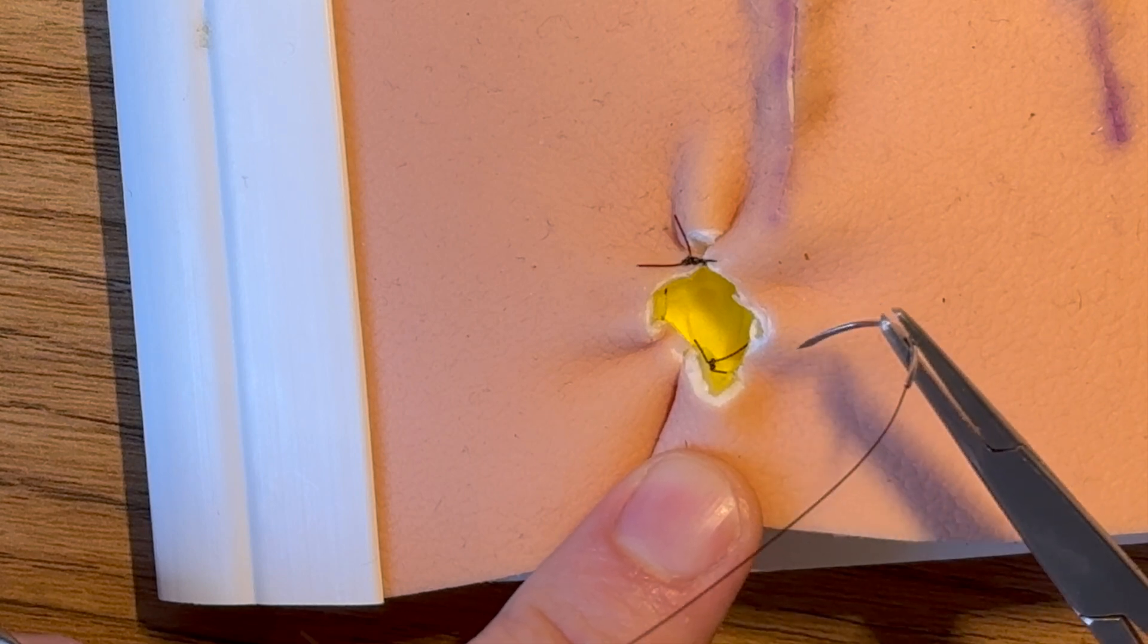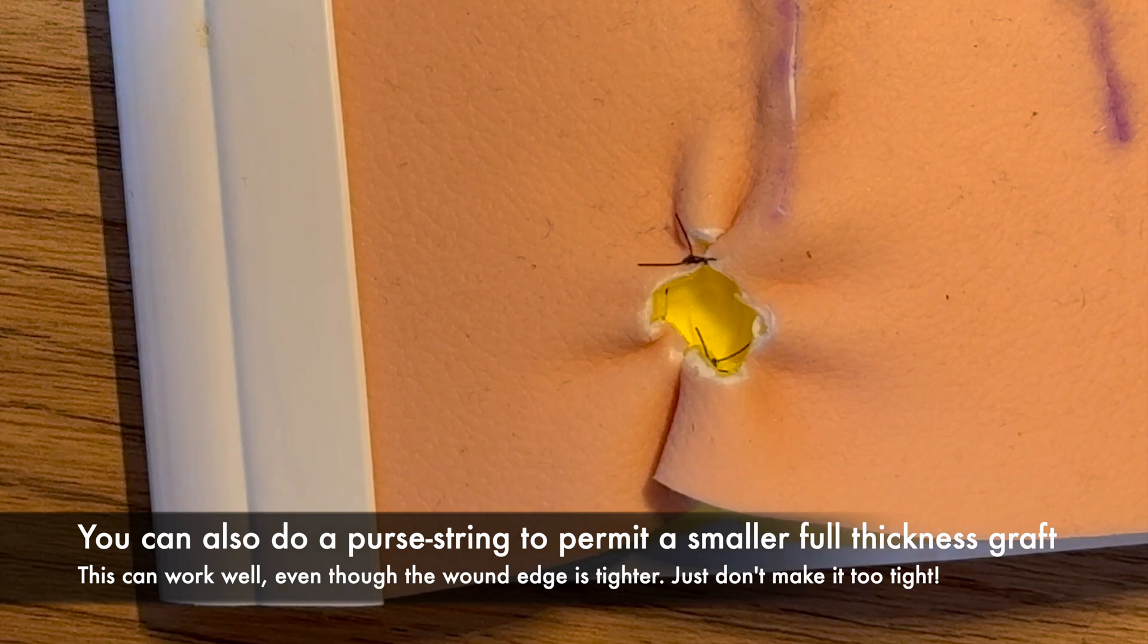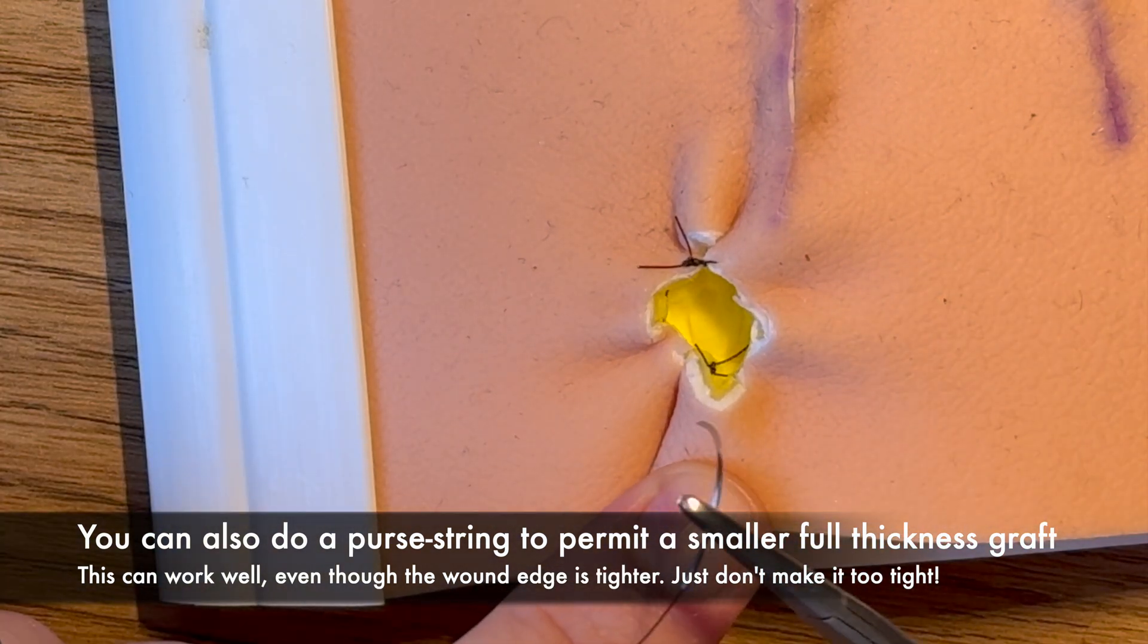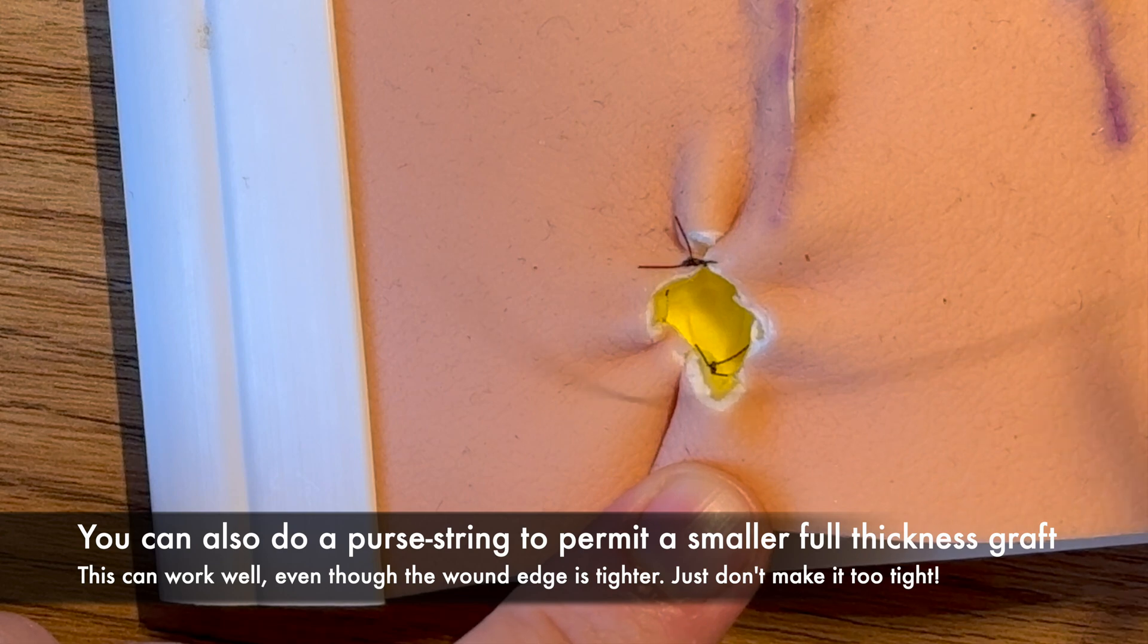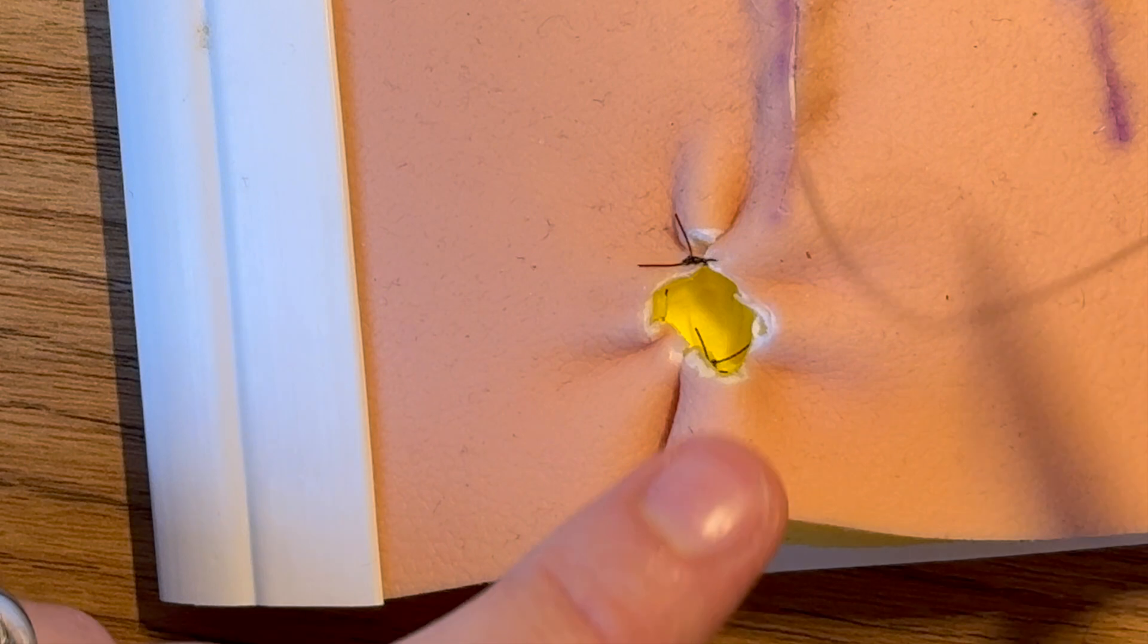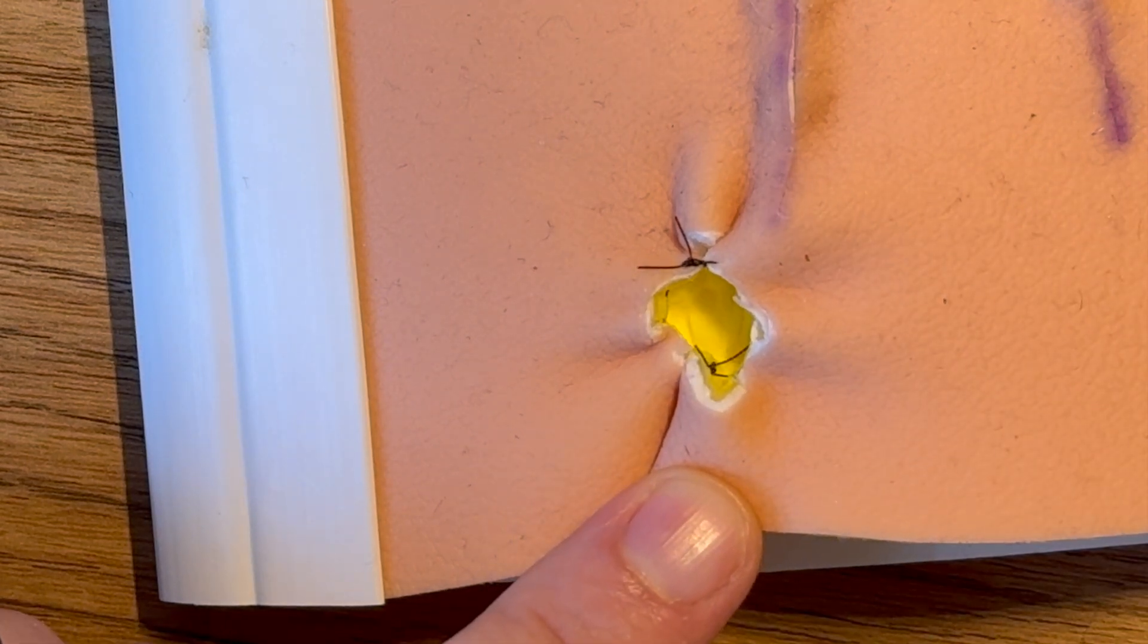So you can leave it for secondary intention and you can use a purse string just to shrink down that area even further. And sometimes that means that then once it's healed you may even be able to just excise the scar and close it directly and make it even smaller after a few months of stretching and what have you.